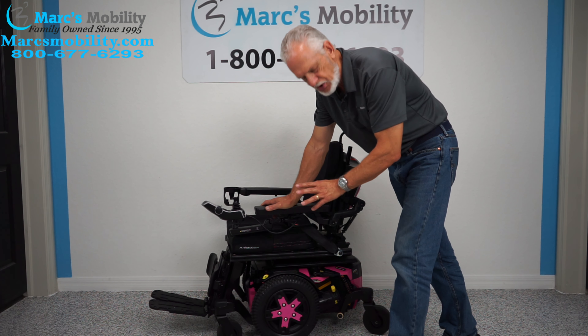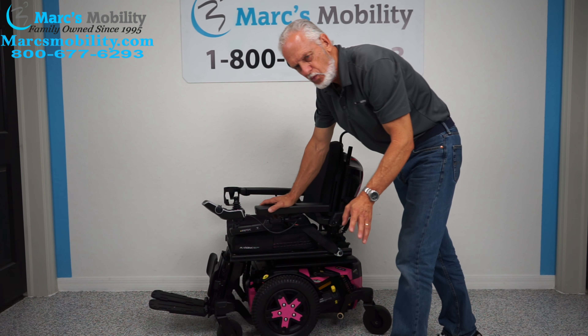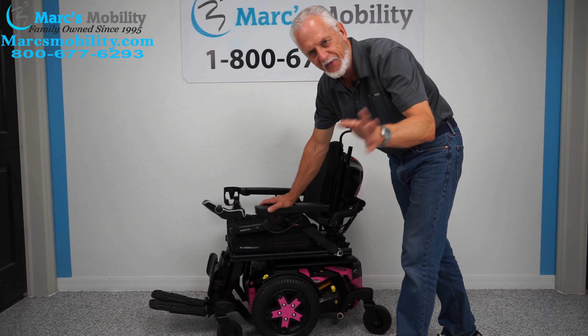If this is the chair you want but you don't like pink, no problem. We can change these colors — there are about five or six color options available.